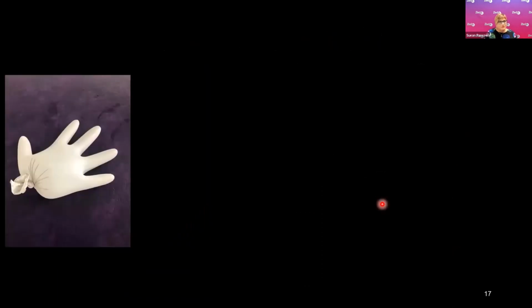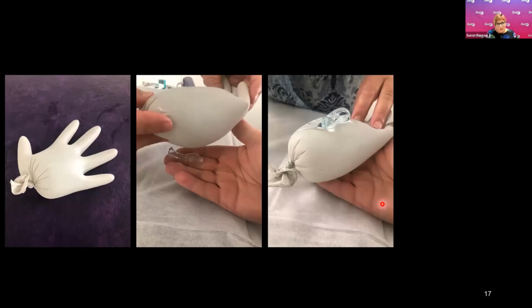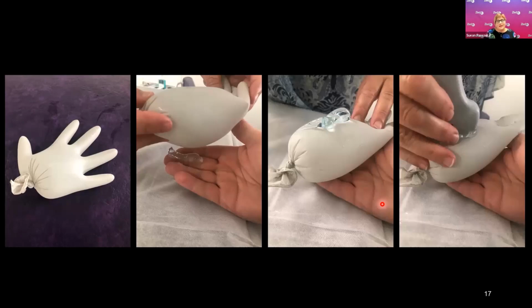Now, to prepare the gel, you find a glove and fill it up with water. Just for your information, it's much easier with a larger glove because you've got more of the wrist of the glove to tie a knot in it, as I found out by trial and error making this talk. I'm going to put some gel on the patient's region of interest, and then I'll place the water-filled glove on top of the gel. Then we're putting gel on the top of the glove, and then we're scanning. The purpose of all these layers of gel is that we need to eliminate air gaps along the pathway from the ultrasound probe to the region of interest. This technique does work quite well, but of course you need to be careful. If the patient is really tender, we've got a bit of weight sitting on their hand, so they might not tolerate it so well.